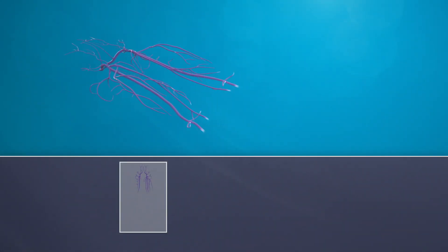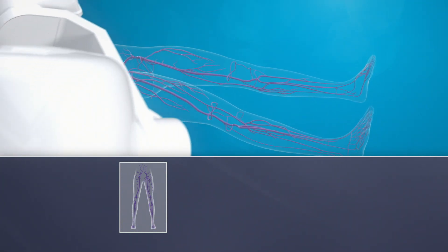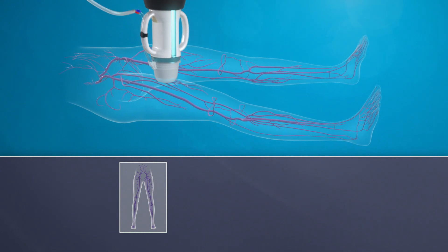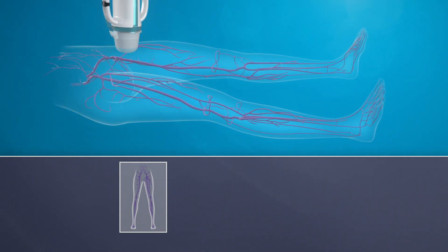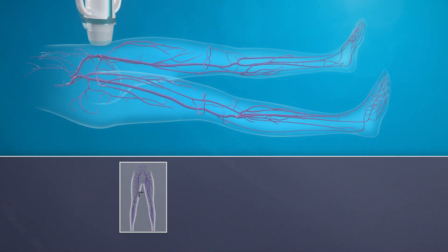The treatment is a simple outpatient intervention. To start, the operator positions the system's treatment head on the patient's leg. The fine-tuning of the positioning is controlled via the system.